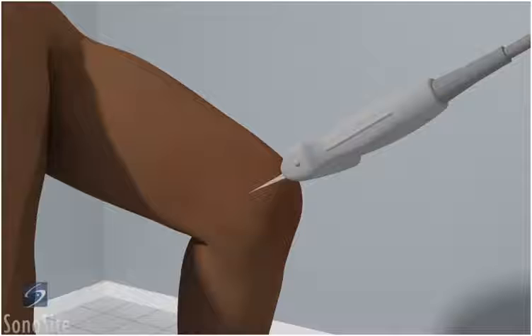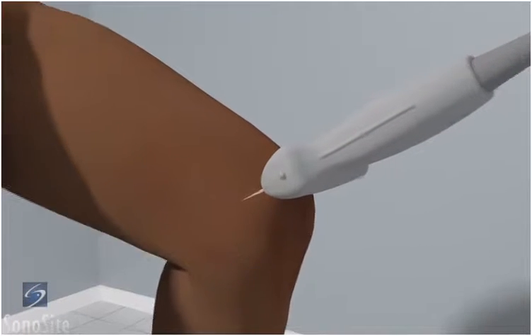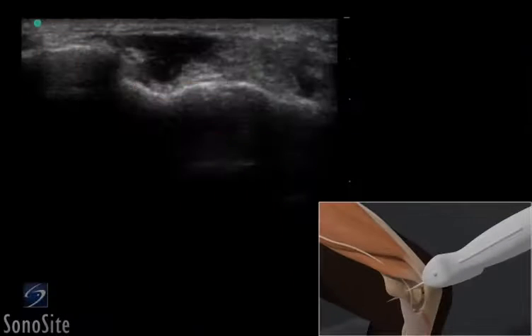The transducer is placed over the distal posterior arm in a transverse fashion with the orientation marker directed toward the patient's right side and the olecranon facing the examiner. The ulnar nerve can be seen as a hypoechoic oval structure. The medial epicondyle of the humerus and the olecranon process can be seen as curved, bright hyperechoic surfaces that form the epicondylar groove.